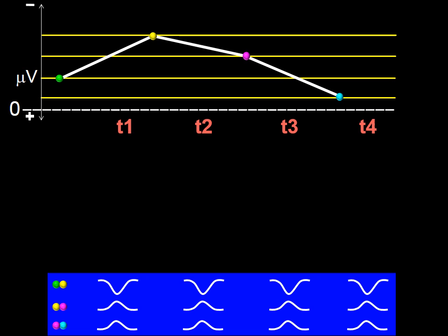Now, were we to change the montage to a common electrode reference montage and assume that the potential captured during this recording is the same as the potentials captured during the bipolar montage, we will see something quite different. The tracing collected in such circumstances will, unlike the bipolar recording, change over time.